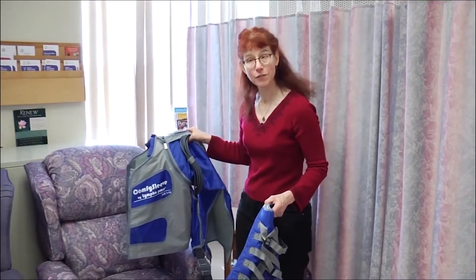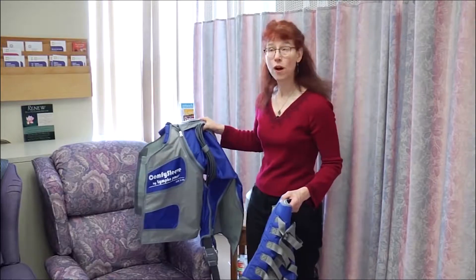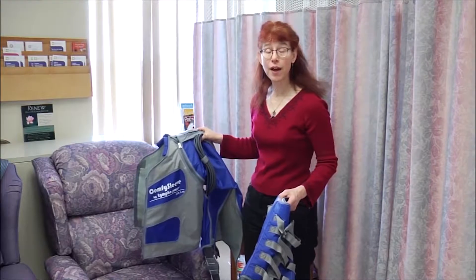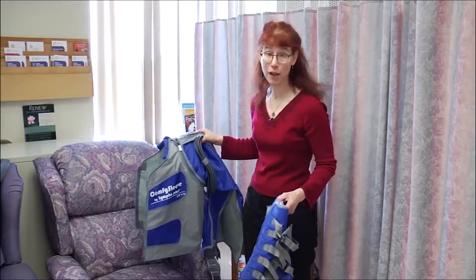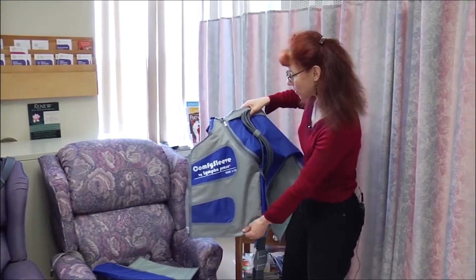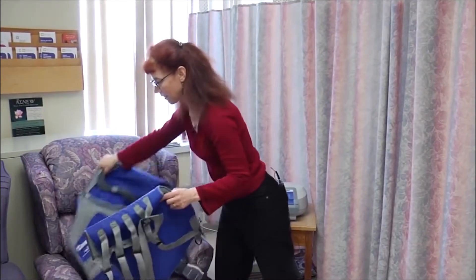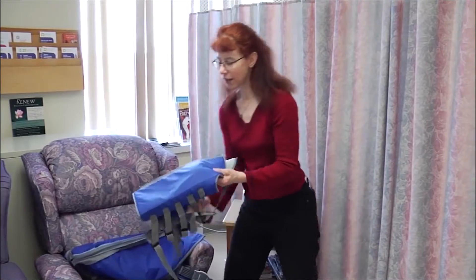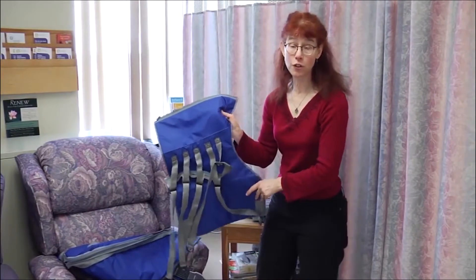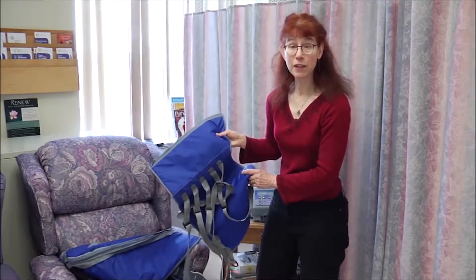This is the comfy sleeve, or comfy arm sleeve, and it treats one side of the upper body. It would be used for someone who has unilateral arm and torso swelling. It can be used to treat either side of the body, and there are different side adapter pieces that come in different sizes — larger ones for larger patients and smaller ones as well — and they come in left and right.